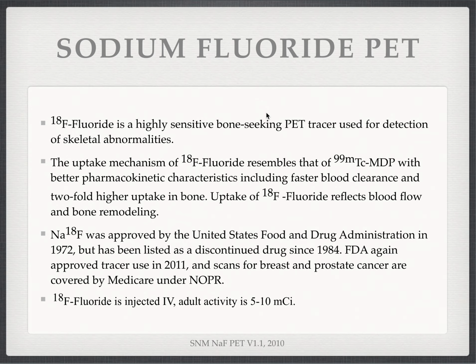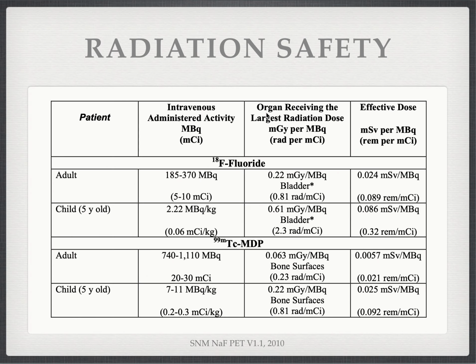All right. With that, since that scan was looking at us accusingly, we'll switch to the sodium fluoride PET. And what it is, it's essentially a same bone scan agent that works with a PET scanner. It was originally approved in '72, sort of died out, and then about a decade ago there was a shortage of technetium for bone scans, so there was a little bit of a resurgence, but again it rapidly died down because of expenses.